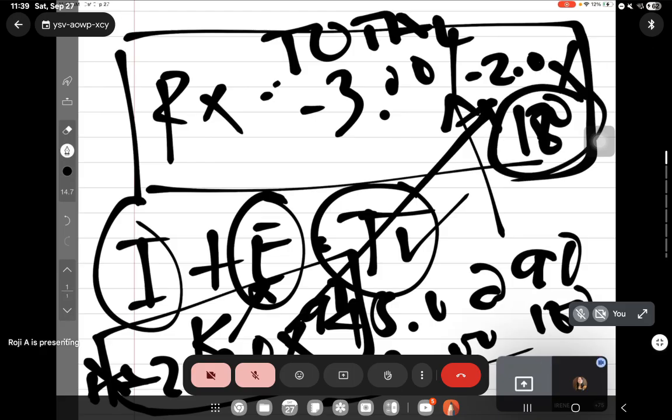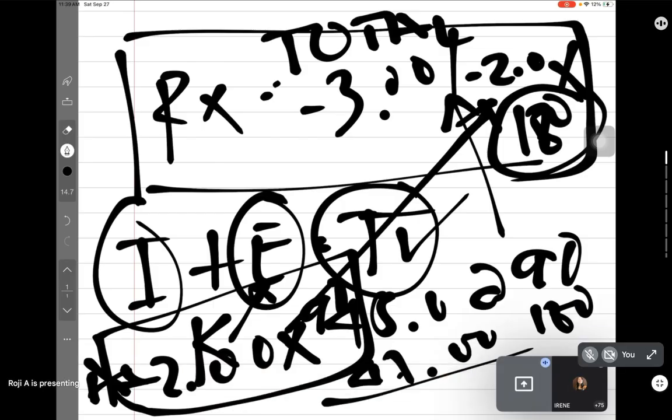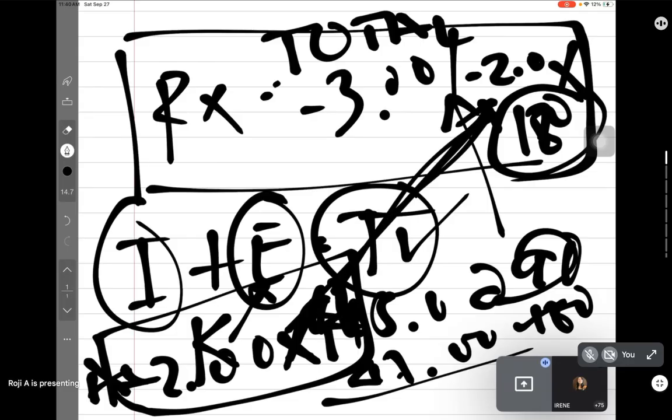The K reading is 45 at 90, 47 at 180, so steepest at 180, flattest at 90, therefore axis 90. Are they the same? No po. No, they're not the same.